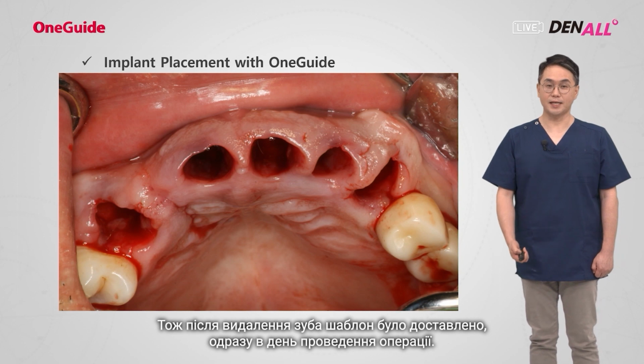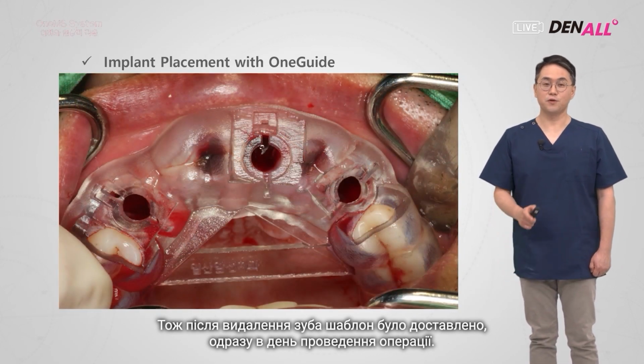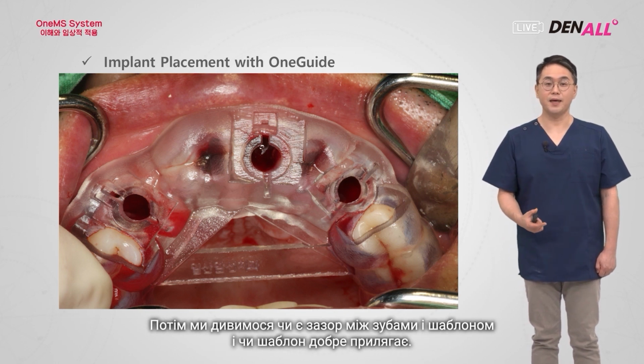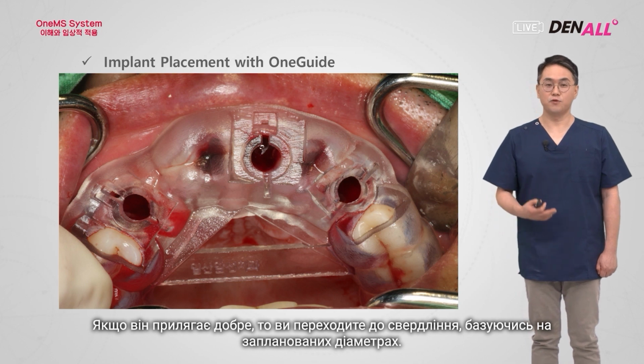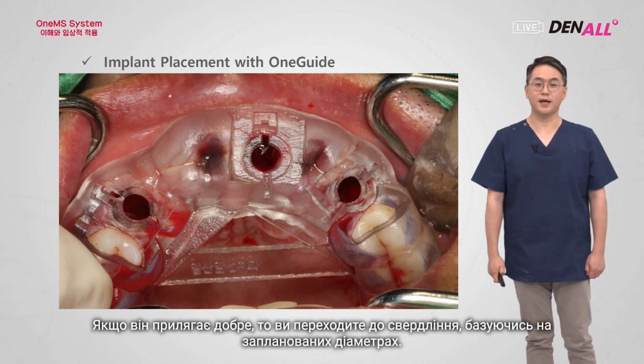After extraction on the day of surgery, the template was delivered, and then we saw whether there was a gap between the teeth and the template, and if it fit well. If it fit well, then you go for drilling based on the diameters that you planned.